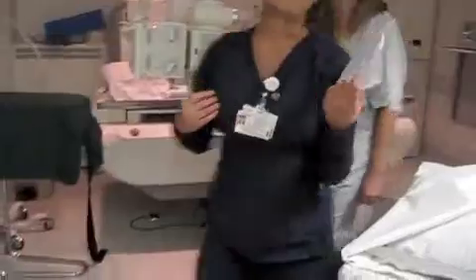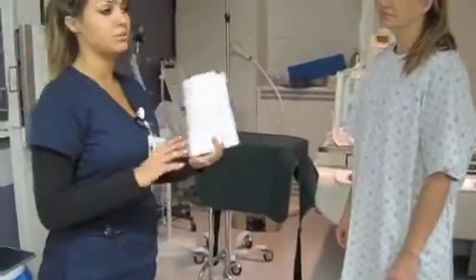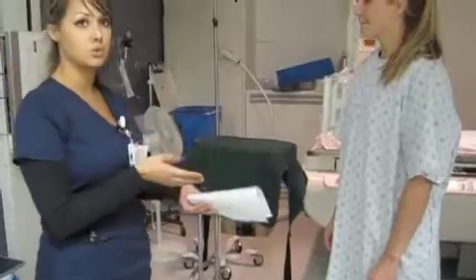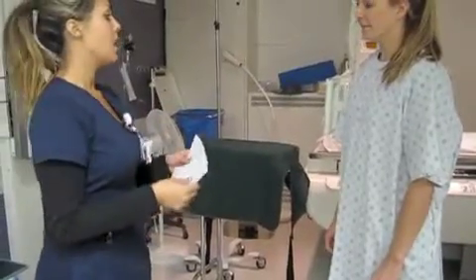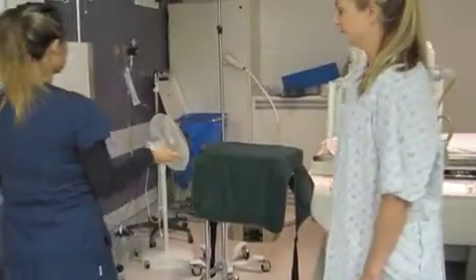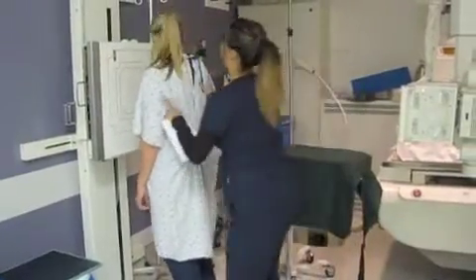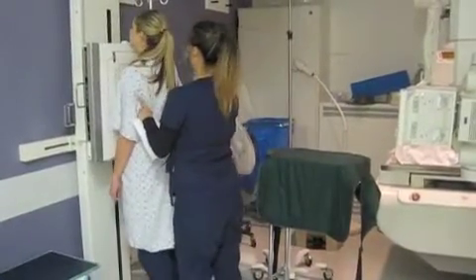And I'm going to have my patient change into a gown, make sure she has nothing on from the waist up, shirt removed, bra, any metal, any jewelry, necklaces, belly button ring. She has it all taken off, and there's no chance she could be pregnant. So come right over this way. What brings you in today? I have a cough. Okay, so I'm going to have you go ahead and face this board.